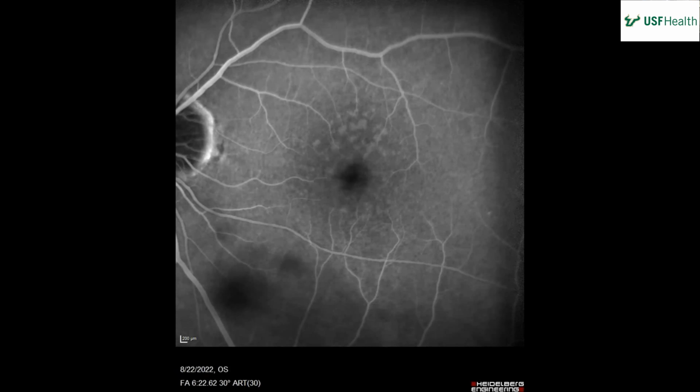My definition is that as the fluorescein progresses, you have a very ill-defined edge and it gets bigger and bigger and more intense. With the drusenoid RPED with the hot cross buns, that edge is sharp. It's filling the RPED. I don't call it pooling. I'm not sure what I call it, but because the edge is sharp and it doesn't expand, I do not call it pooling.